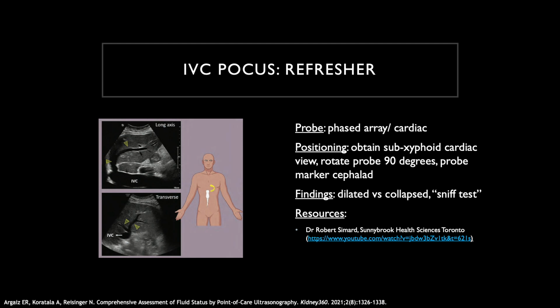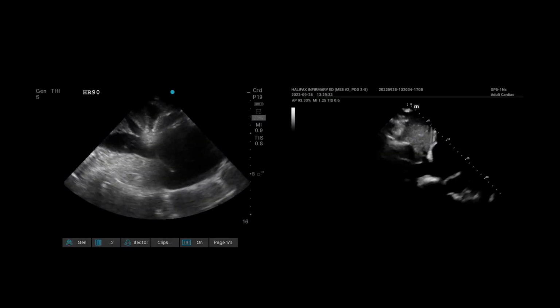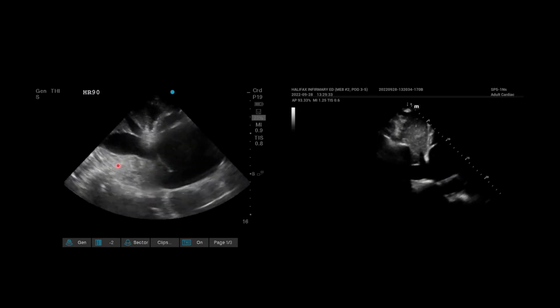For a more thorough instructive video on assessing the IVC, here's a link to a resource by Dr. Simard at the Sunnybrook Health Sciences Center in Toronto. In our patient, the IVC appears to be quite dilated as it feeds into the right atrium.